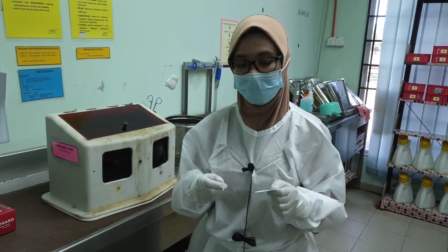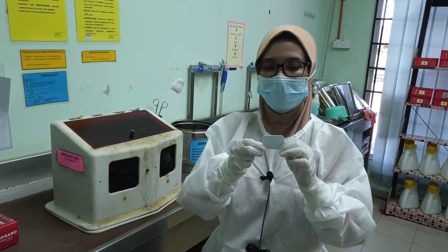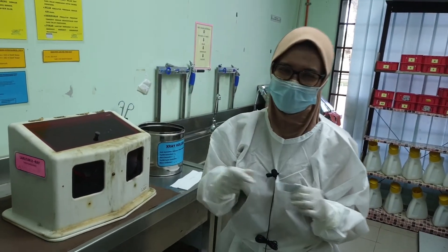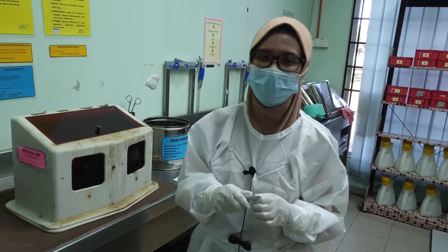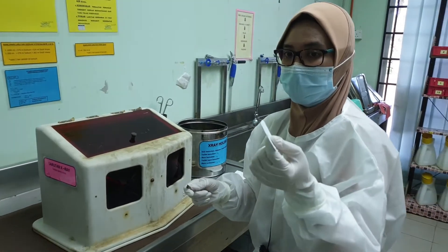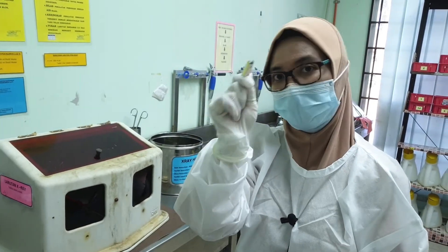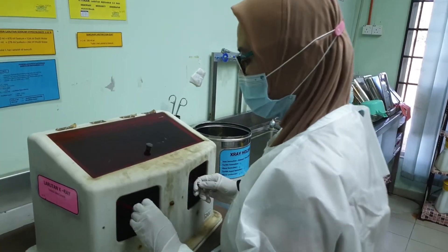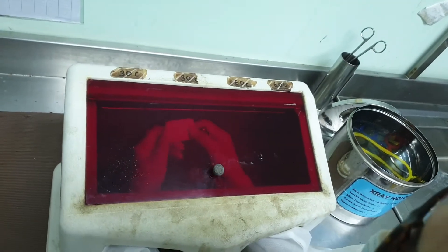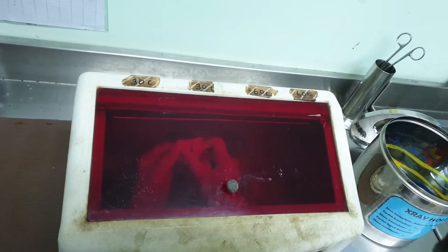I would like to show all of you how I'm going to process this x-ray film. By right, you need to switch off the room light, but for this recording purpose I will keep it on. Your left hand will hold the film and your right hand will hold the clipper. Place both hands inside and you can start to peel your x-ray film envelope.